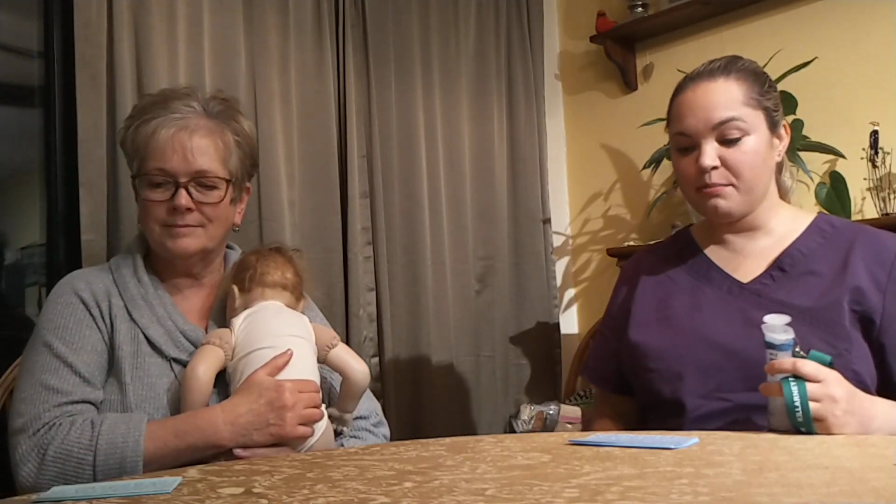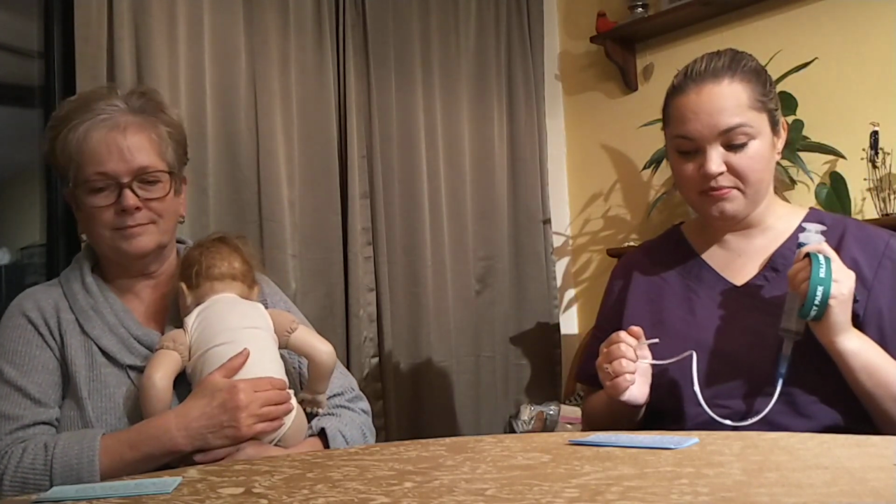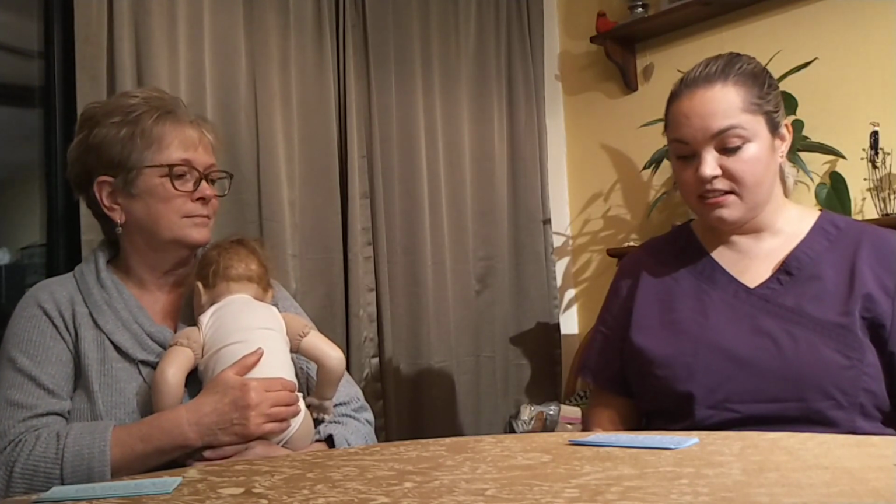We're going to be talking about lactation aids, specifically a supplemental nursing system, or SNS for short. This is a way of feeding a baby at the breast while also providing extra nourishment. It can be helpful when babies have a weak suck or are not gaining enough weight, as well as for adoptive parents who are inducing lactation or parents who are relactating after breastfeeding was interrupted.